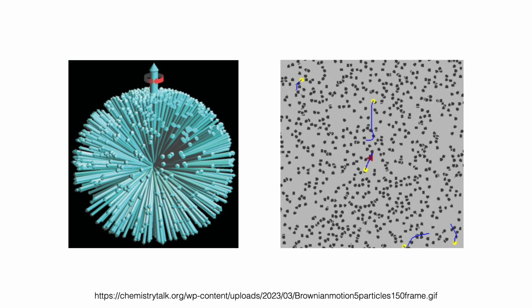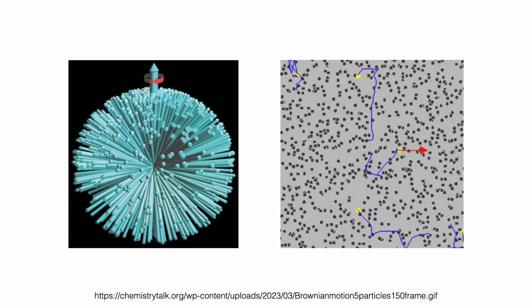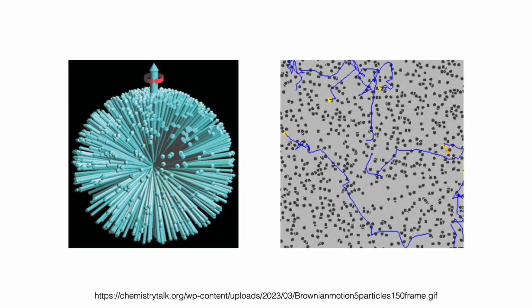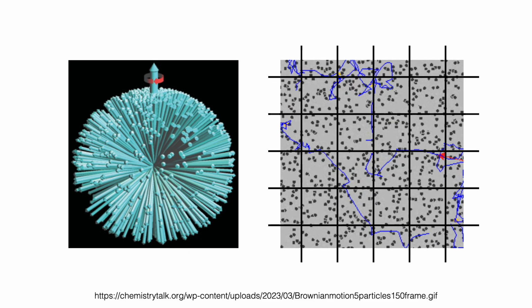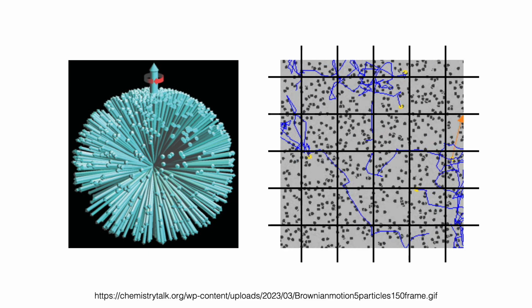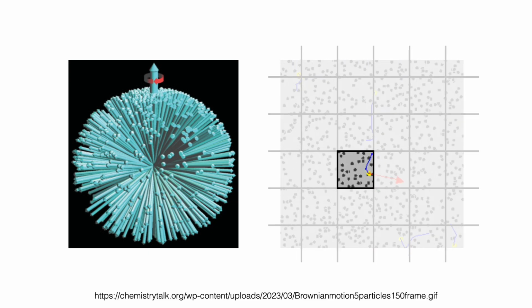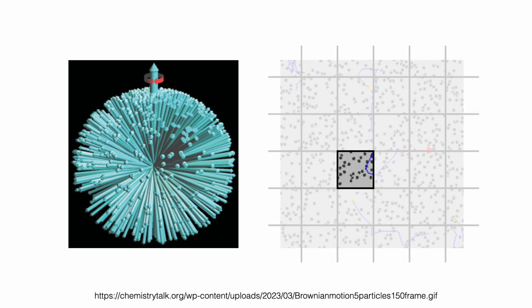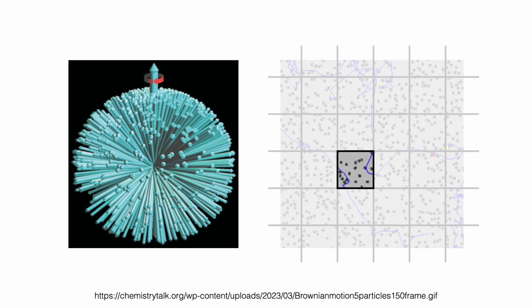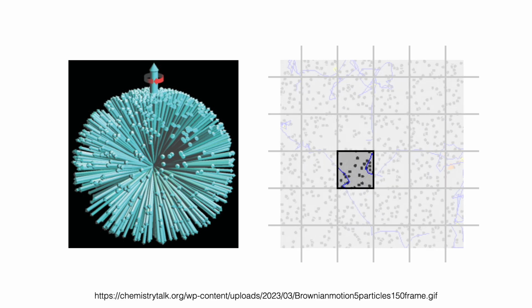This would be the case at 0 degrees Kelvin and everything were frozen. However, at any temperature above that, like the temperature of the human body, particles move. Here, yellow dots are indicating the same particles, and the blue lines are showing the random motions of these particles. So if we impose a grid, and we call each of the squares of this grid a pixel in our image, we're seeing that the same particle enters into many different pixels. And also, if we isolate just one pixel, we're seeing that many particles come and go into this little pixel, so we're averaging different of these magnetic vectors. This causes the noise of MRI.